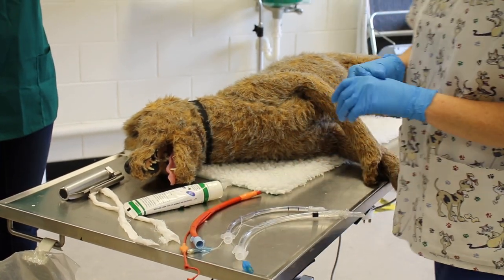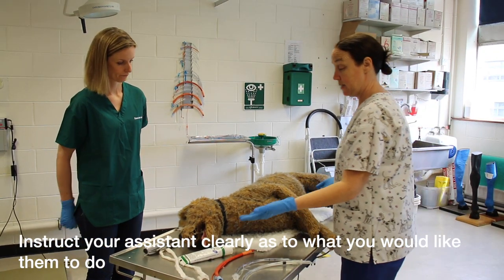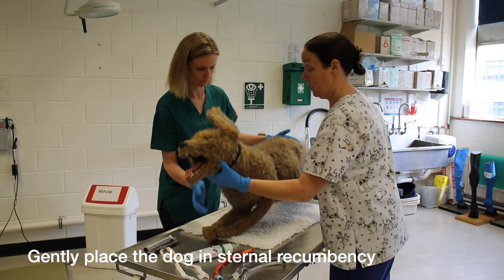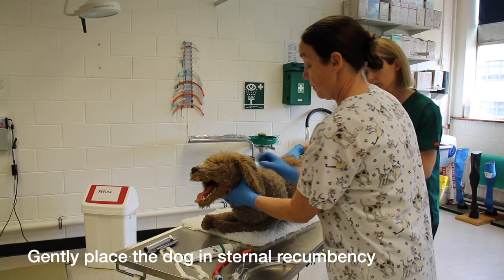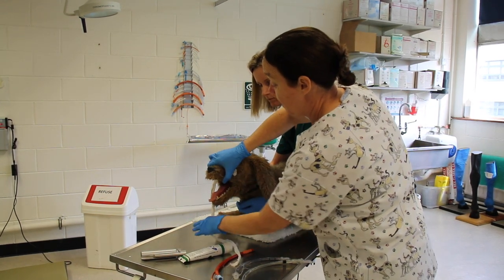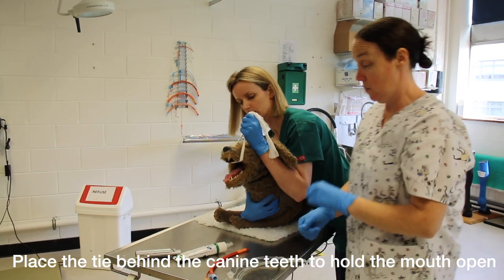At this stage you give your assistant nice clear instructions. So Celine, if you could place our patient in sternal recumbency please, and hold him close into you. I'm going to give you this piece of tape — I'm going to place it behind his canines and behind the side of the tube. If you could hold that towards the ceiling for me. Thank you.